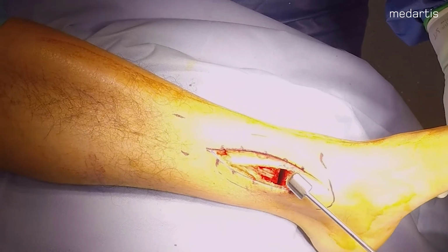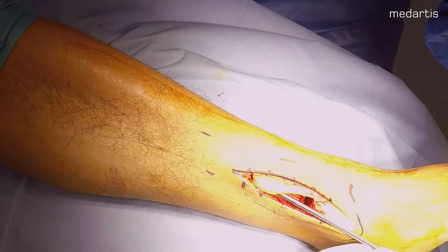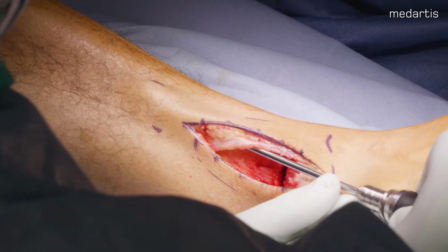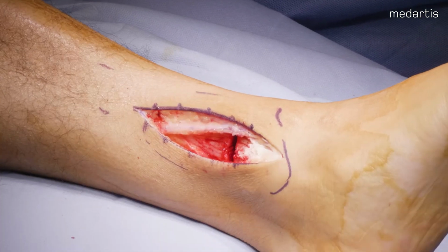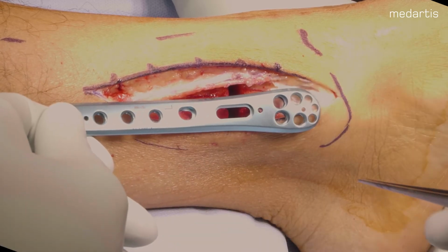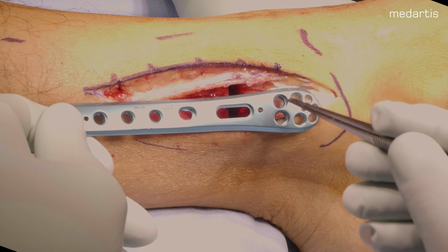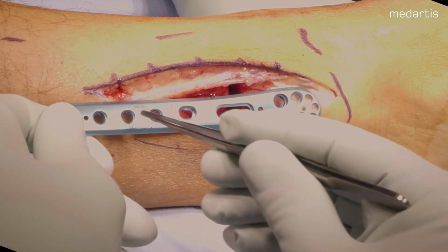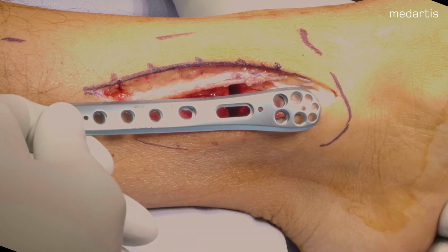The mypotunnel instrument is used to create space under the soft tissue for insertion of the proximal shaft of the plate. The plate has multiple distal 2.8 and 3.5 locking screw holes. The plate has 1 oblong hole, 1 eccentric hole for compression, and 3.5 locking screw holes in the shaft.